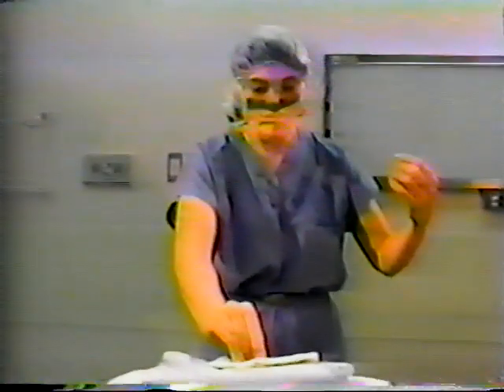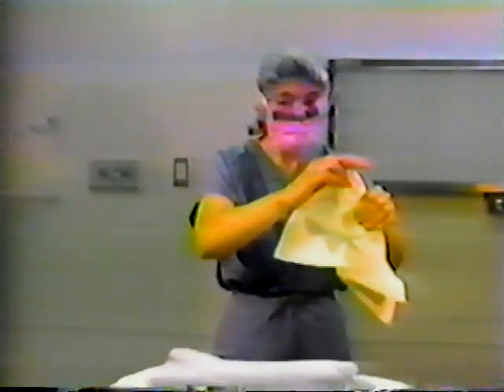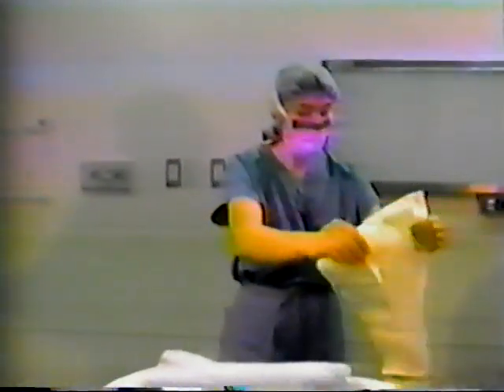The scrub person must thoroughly dry their hands and arms before donning the gown to prevent organisms on the wet skin from strike-through and contaminating the scrub attire. The scrub person will pick up the sterilized towel without dripping water on the gown and move away from the table. Keep the towel away from the non-sterile scrub attire by bending forward slightly.